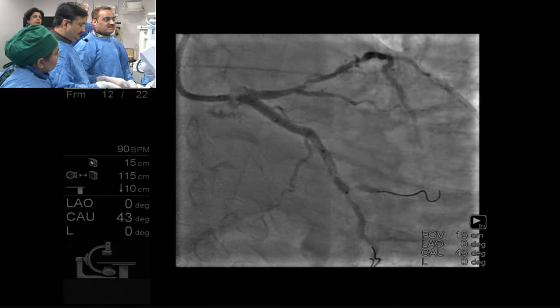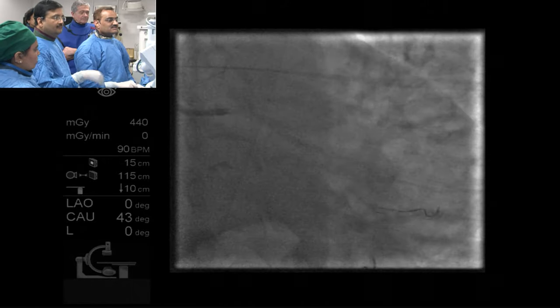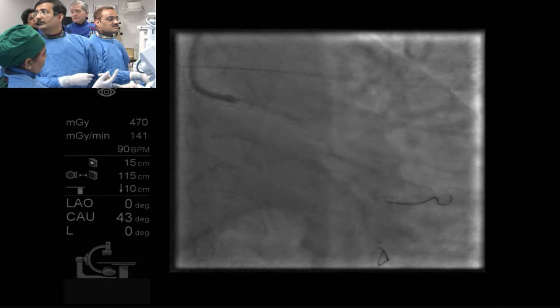So that one is 15, right? That's a good habit. So then we know the stent size to go. So you guys still think I should leave that OM branch alone? No, now it looks worse. Actually, hold on one second. But I bet if you give nitro and verapamil, it'll look better. Stent. 2.25 by 8 stent. 2.25 by 8, 12 or 7. Why not 8?